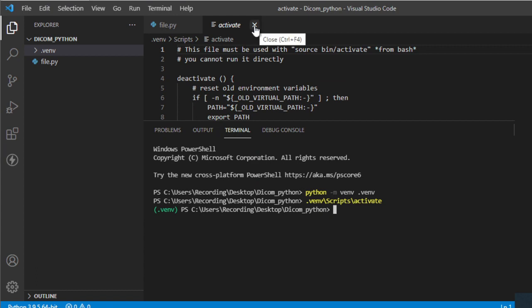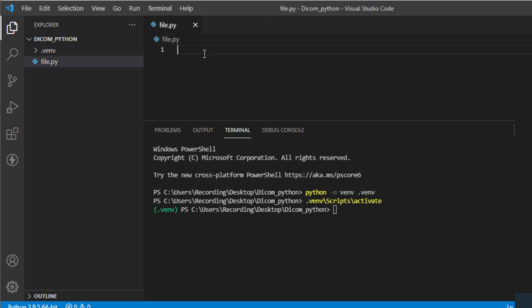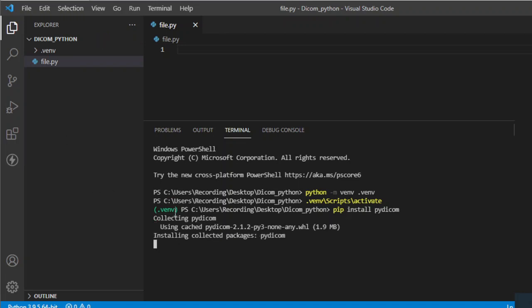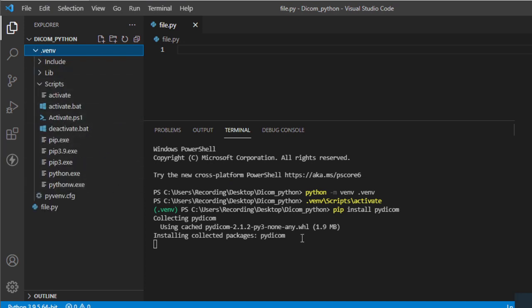Let's move on. Going back, this is our file, file.py. The first thing we need to install is pydicom. To do that, we need to run: pip install pydicom. The difference with this installation is that this pip install will not affect the outer OS — it will install within the virtual environment. All those packages I'm going to install will be installed in this folder.